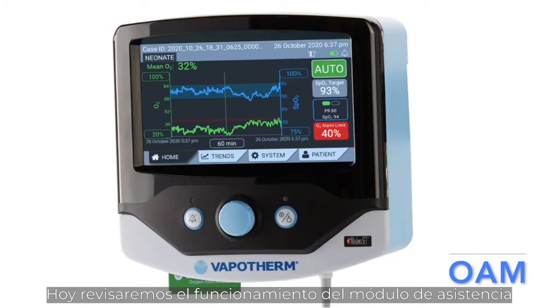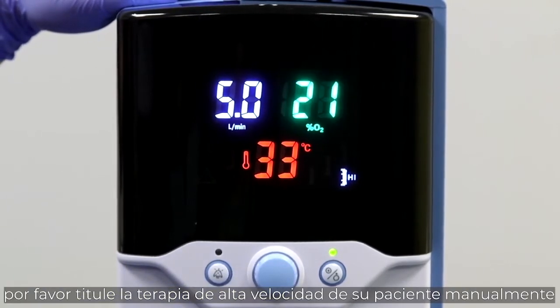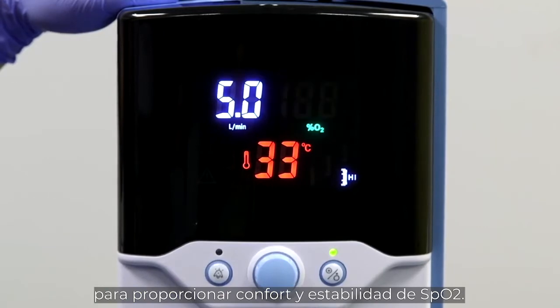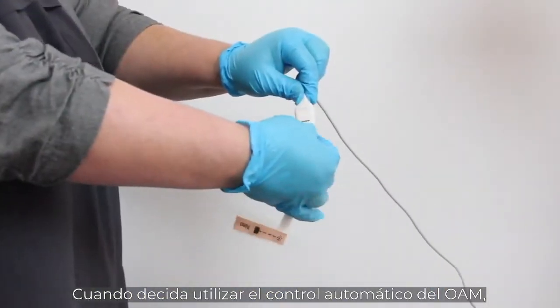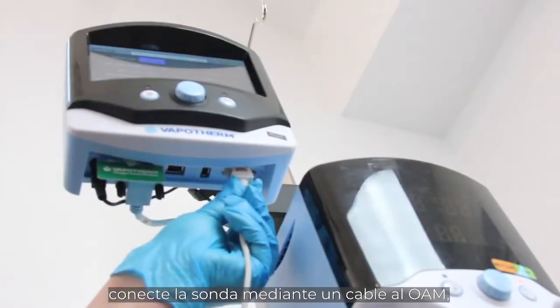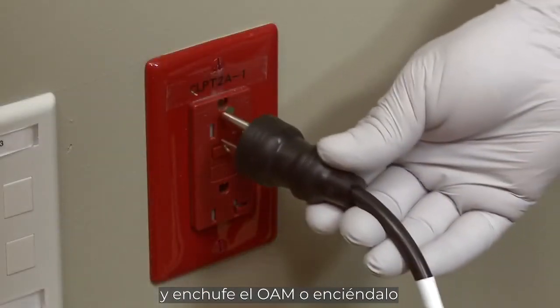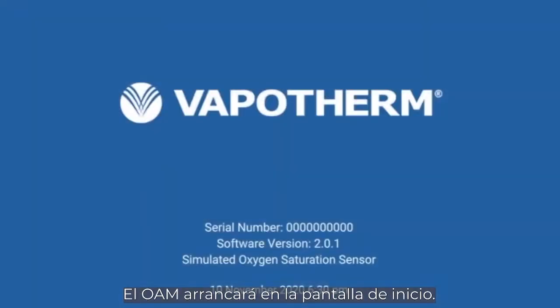Today, we will review the Oxygen Assist module and how to set it up on a patient. Before starting the OAM's closed-loop control, please titrate your patient's high-velocity therapy manually to effect, comfort, and Spo2 stability. When you decide to use the OAM's closed-loop control, please connect an Spo2 probe to your patient, connect the probe via cable to the OAM, and plug the OAM in or switch it on using the on-off button on the front. The OAM will boot into the home screen.